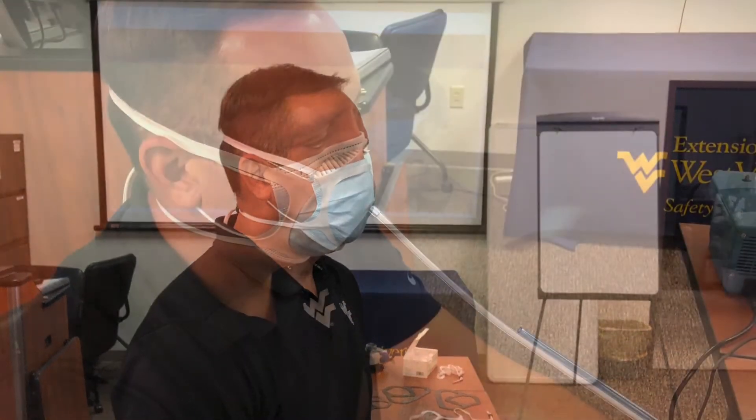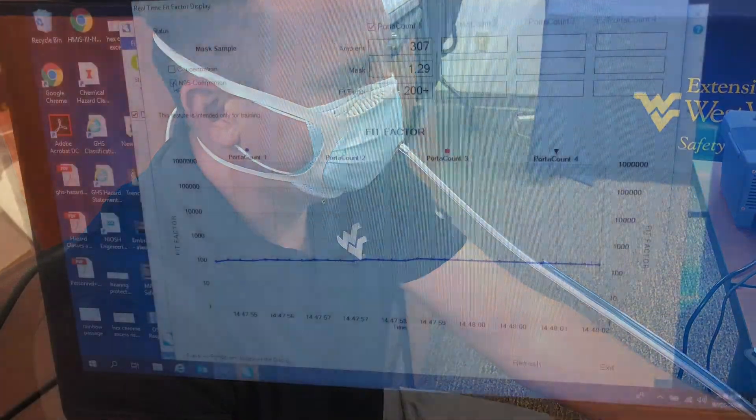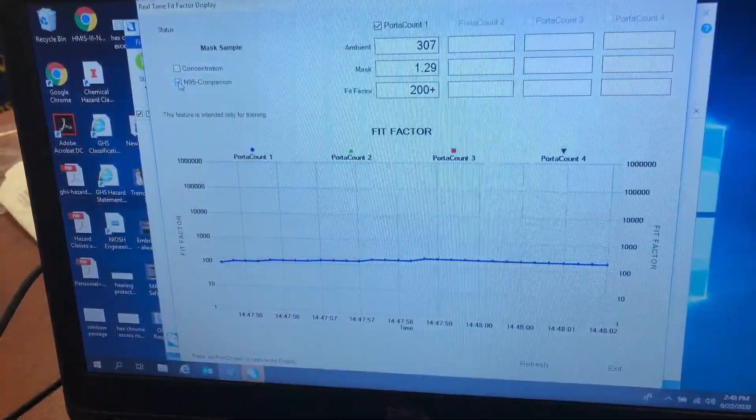Fix the Mask dot com essential brace version 3.0 — the version three fit test was also greater than 100 and achieved a fit factor over 200. The fit test was passed.